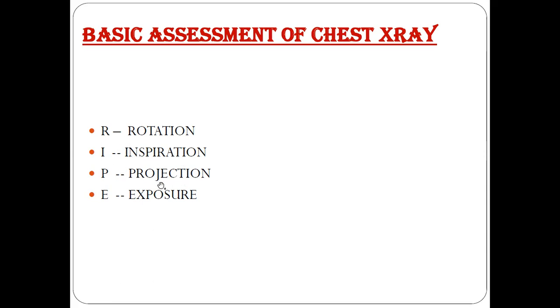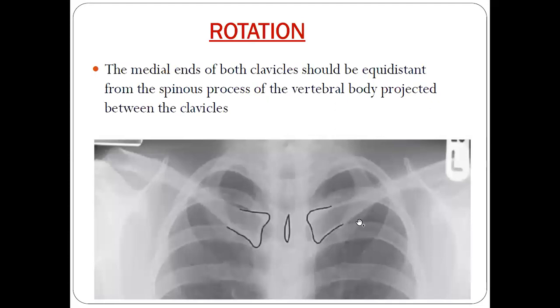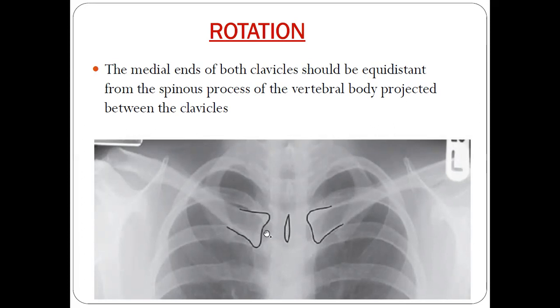In this video we'll be talking only about rotation. When you look at a chest x-ray, you can see the spine and the spinous process. You measure the distance between the spinous process and the medial end of each clavicle. If the distance is equal on both sides, the x-ray is centrally placed with no rotation.